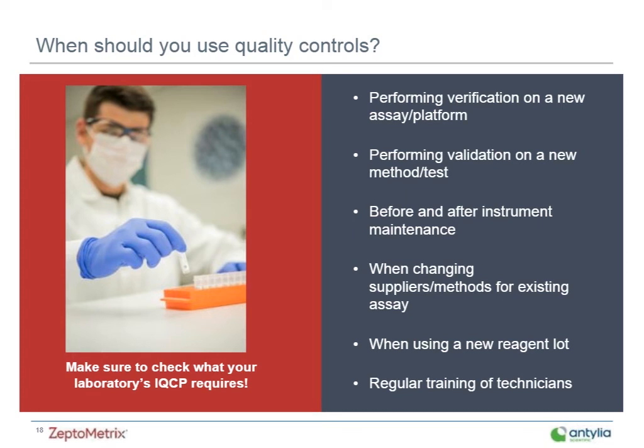IQCP really should be as restrictive or more restrictive than what the assay manufacturer provides. And you can find a step-by-step guide for developing an IQCP on the CDC website if you don't already have one in place. I think here are some common instances in which you should consider running external quality controls.